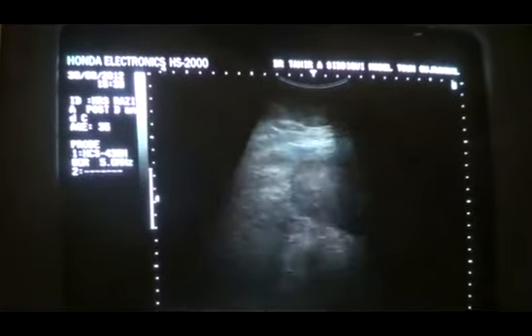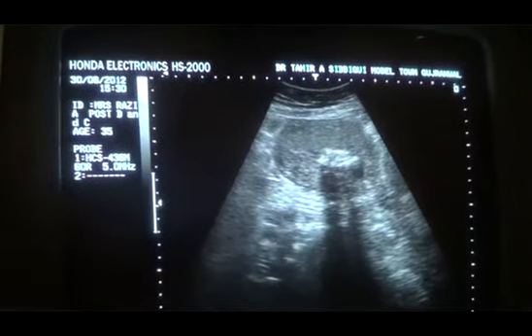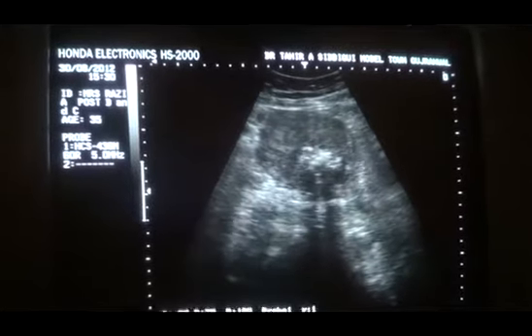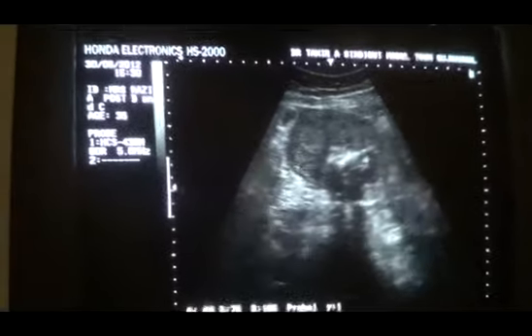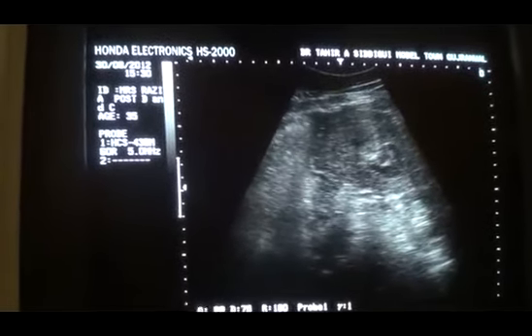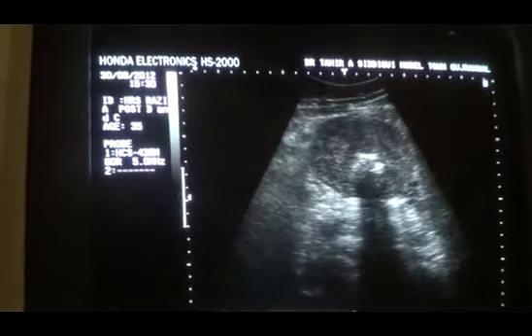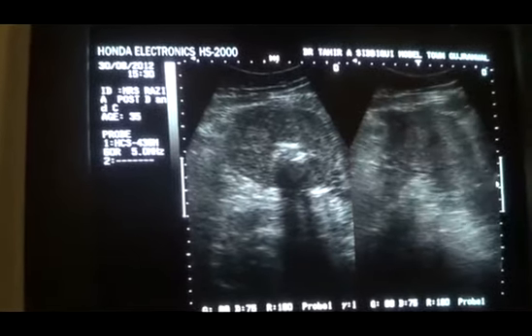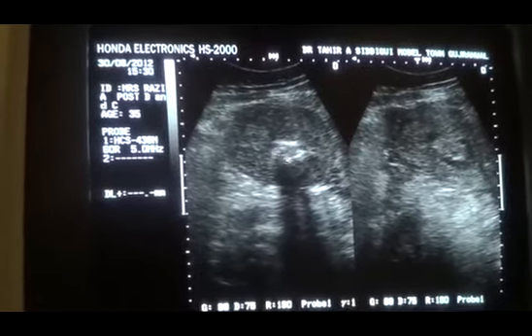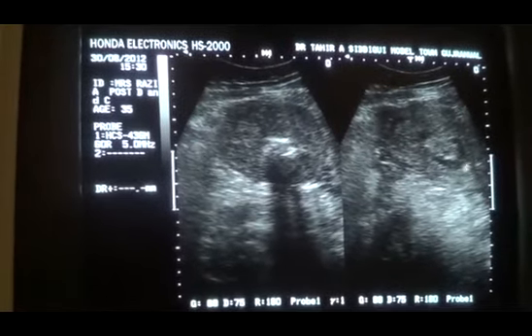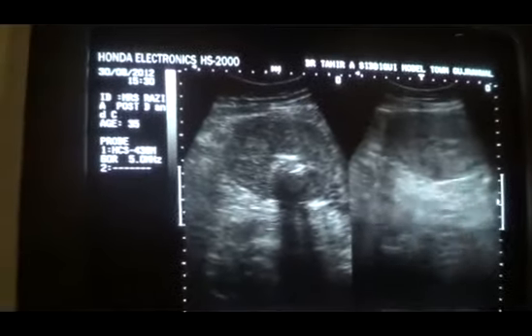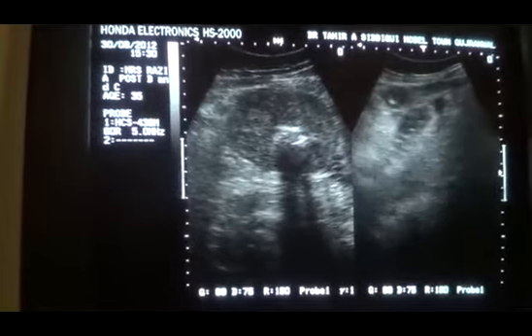So the pathology is: number one, there is blood and RPOCs within the dilated endometrial canal post-DNC, with a breach in the anterior myometrium. This is the dilated endometrial canal with RPOCs. A breach in the anterior myometrium is the cause of fluid in the peritoneal cavity.